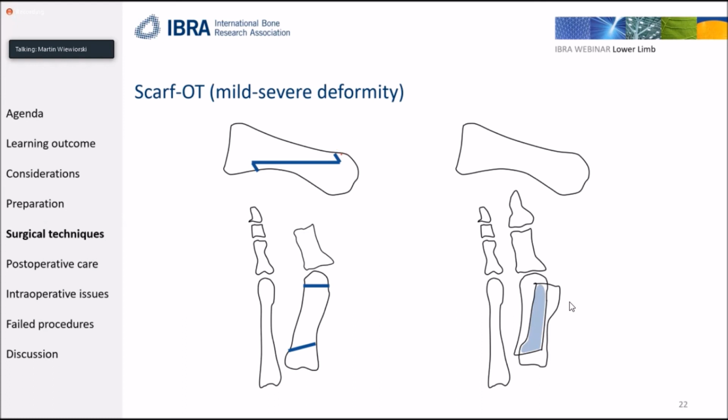So at first, maybe how is this osteotomy done? I guess you guys have seen it before. You find the middle of the head. You go just 1/3, 2/3, and this is basically your starting point for the upper cut, which is a little bit oblique. And there's a long cut, basically to the lower third of the diaphysis or metaphysis, also around 2/3, 1/3, and you have to do it with a reciprocal, so you have to do an oblique cut up here. But this can vary, and in the later case, I'll show you why this makes a difference.